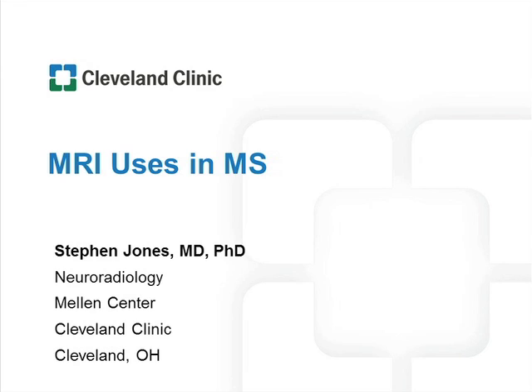He will make sure we have useful tips for sorting out what constitutes MS and what is probably not MS. He will deal specifically with the vexing issue of nonspecific MRI white matter changes, which increase in frequency with age. His 12 tips for MRI use in MS constitute a wealth of concrete and clinically pertinent information for all neurologists.